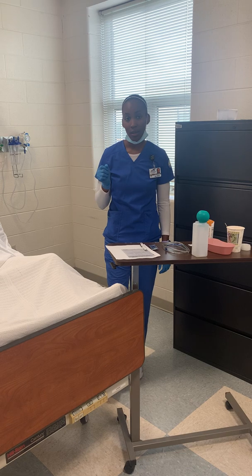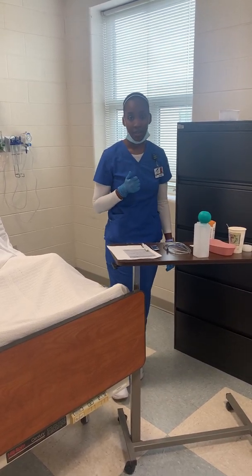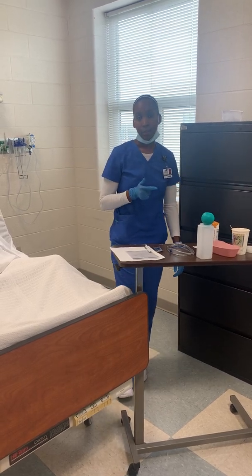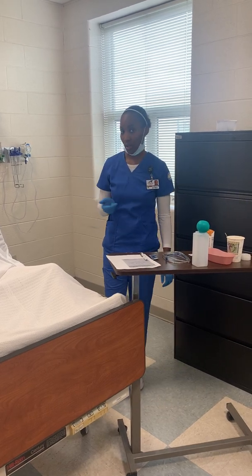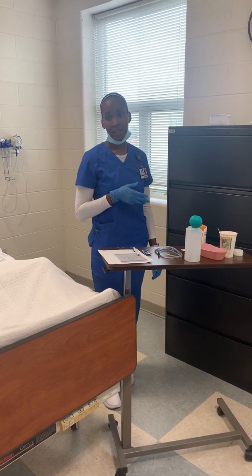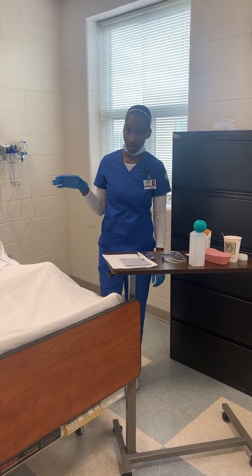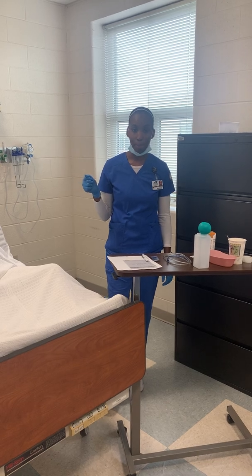I'm going to knock on the patient's door, identify with 2 identifiers. I'll note the overall condition of the patient, and then I'll draw my curtain for privacy and explain the procedure. I'll raise the bed for good body mechanics. Then I'll put on appropriate PPE. Once I'm done with my procedure, I will lower the bed back, give them a call light.